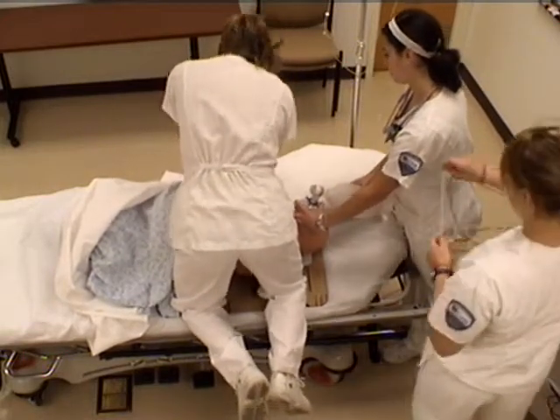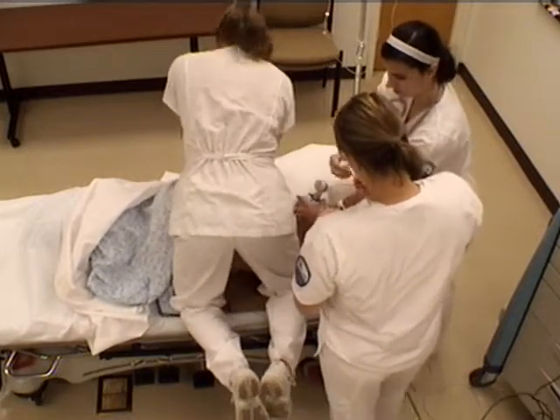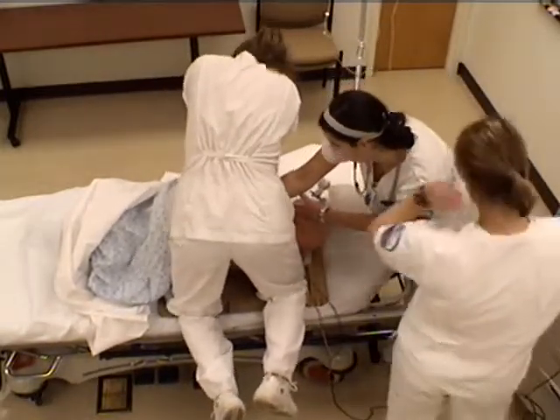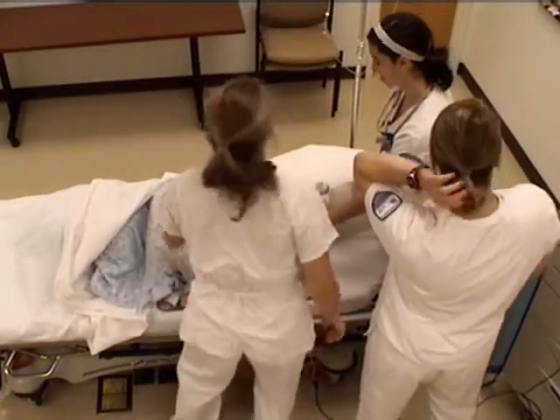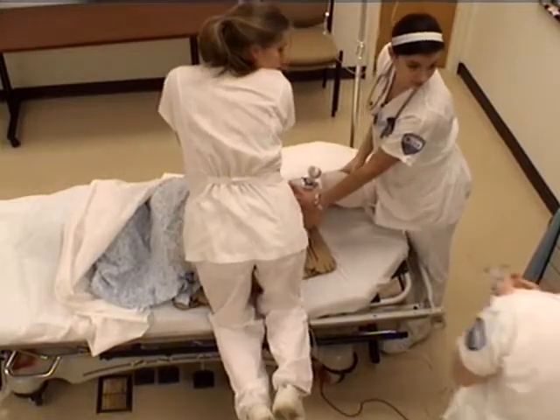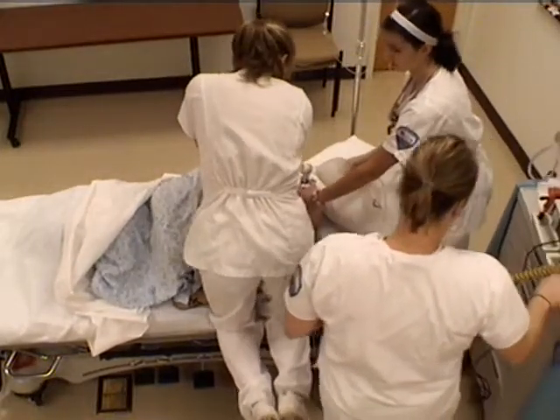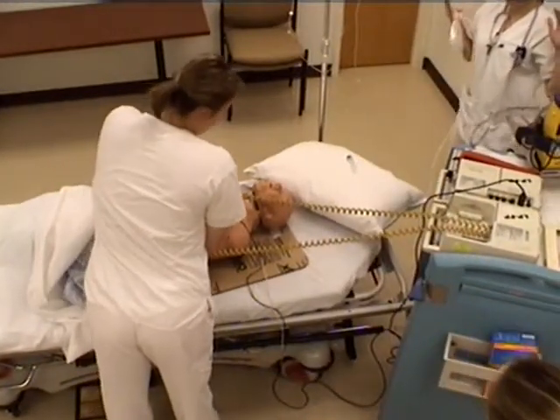Here. Eight. He's up. Right. Right now. Three. What's his rhythm? Rhythm one. Okay, he's a shockable rhythm. Shock. We can shock him. You're the shocker. Okay. Five — hands up to 200. Okay, all right, we're going to shock him. Clear. All clear. Charge. Shock.